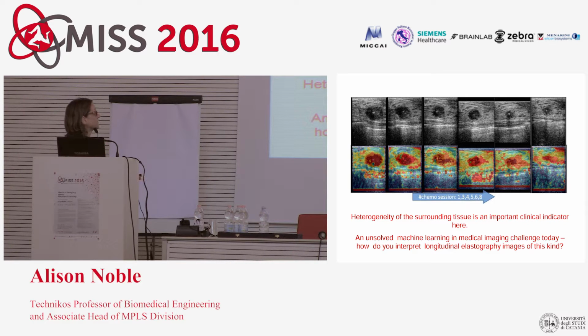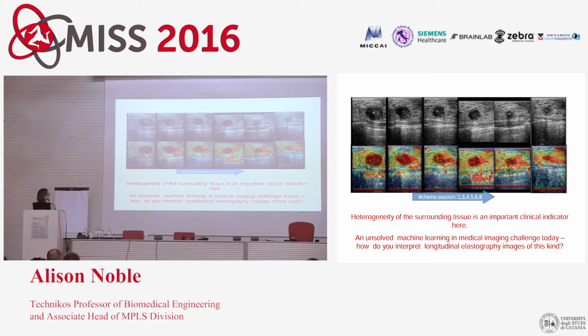There's no alternative today for doing this, because the way you really look at change would be by doing histology, and clearly during a chemotherapy or during any therapy, you cannot take histology, otherwise you've changed the whole process. So being able to use ultrasound would be a really good way to monitor how a given therapy works over time.